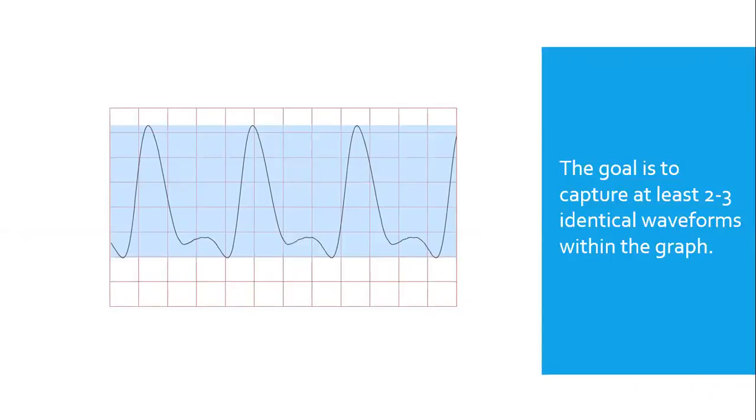It is okay to scroll back and forth once you've stopped the test in order to fit the waveforms properly on the graph.